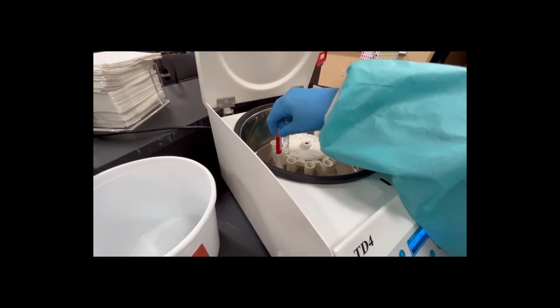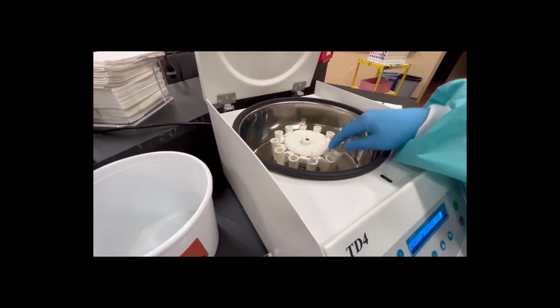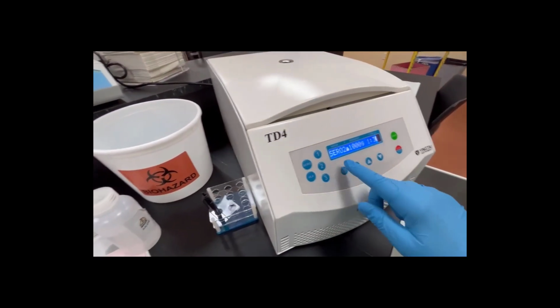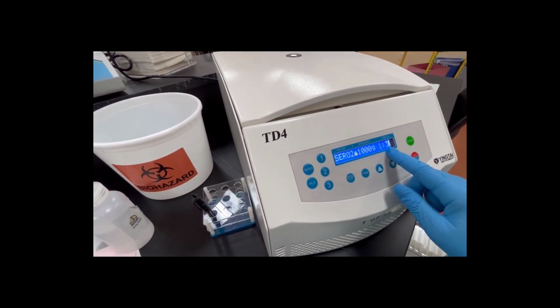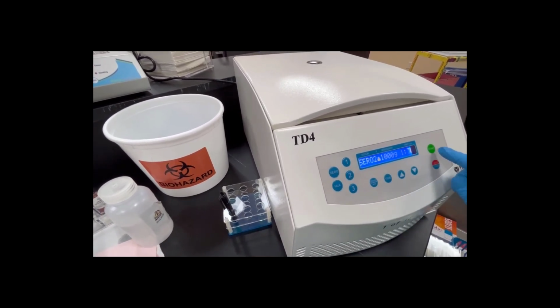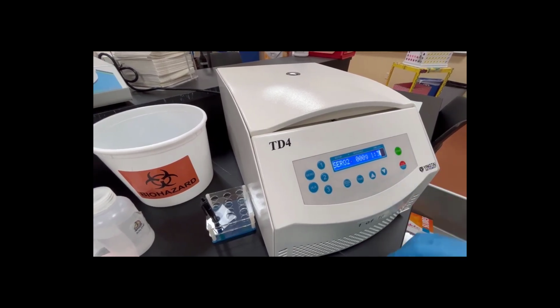I'm going to put them across from each other. We're going to balance them in the Serafuge. Make sure they're across from each other. We're going to close it. Now I'm washing it, so we're on 02, and you can see I did fix this one. I'm not sure what that D6 was before, but I fixed it. 02, and I'm going to hit start, and the Serafuge is going to run.